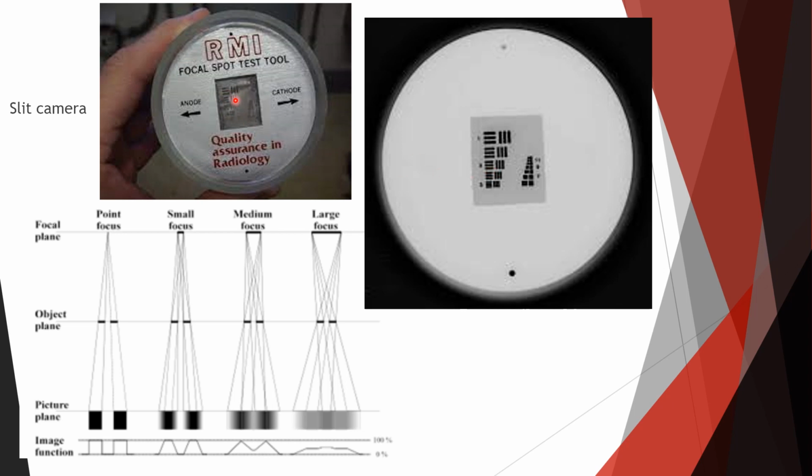Okay, and this is the focal spot test tool. All right, and this is what the output would look like.